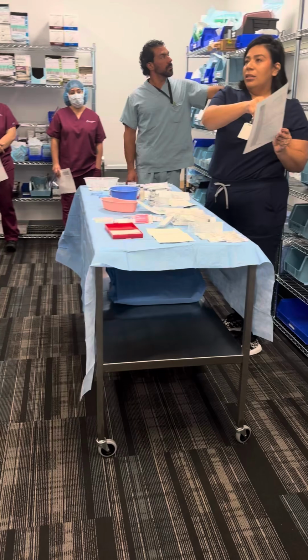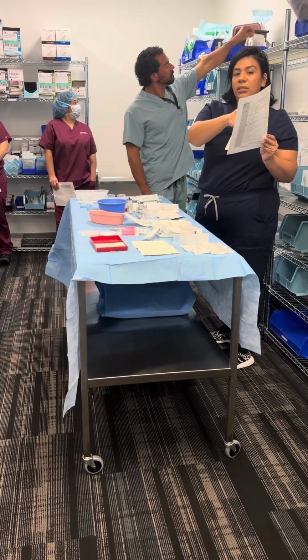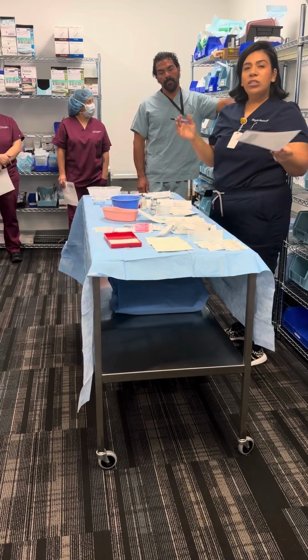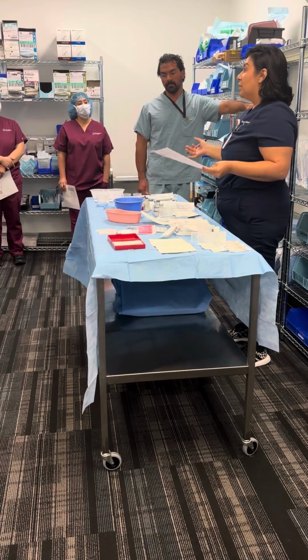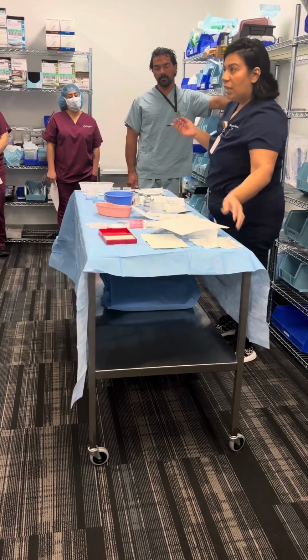This is the syringe that we started with. This is the amount that was injected, and this is how much was left over. I don't want to know how much is left over in the syringe. I want to know how much is injected because the nurse is going to ask how much was injected, how much local did we use, and so that's the number that you're going to give them.